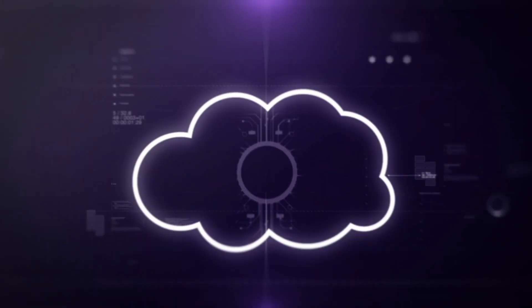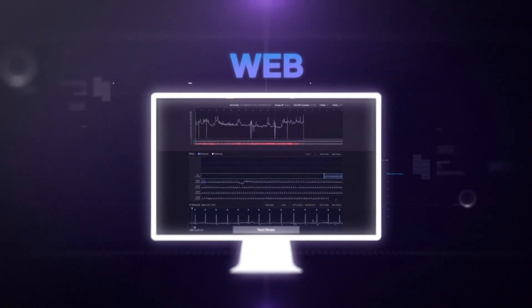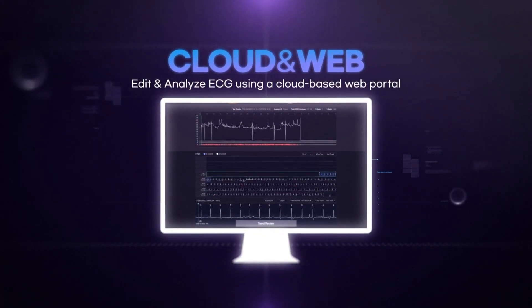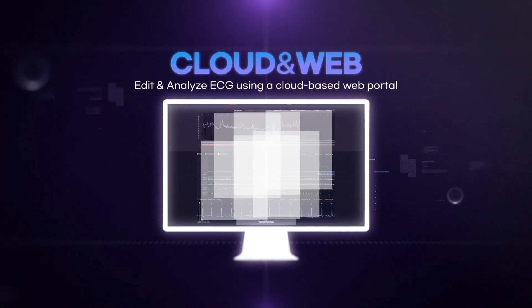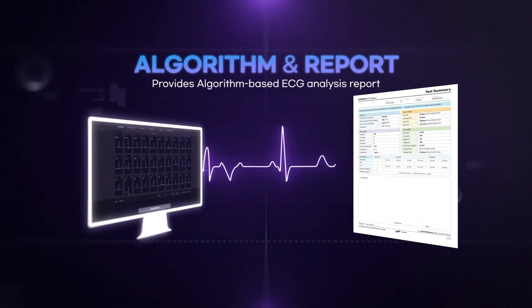Test data is stored on a cloud server. Authorized medical staff can edit and analyze the test data anytime and anywhere. With algorithm-based data analysis, Aspatch provides more precise electrocardiogram analysis reports.